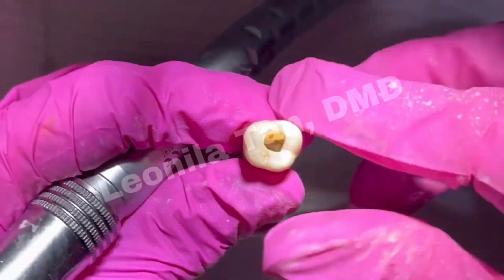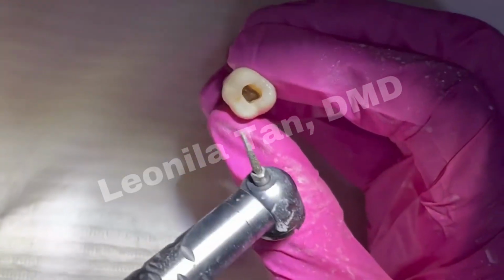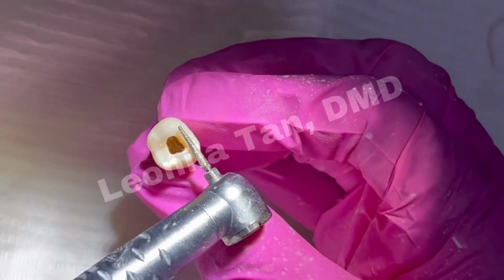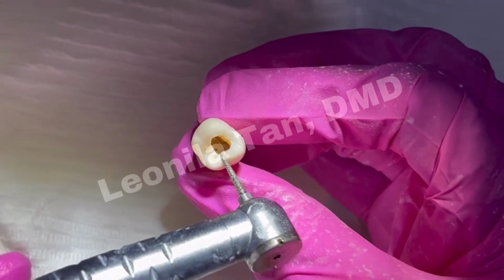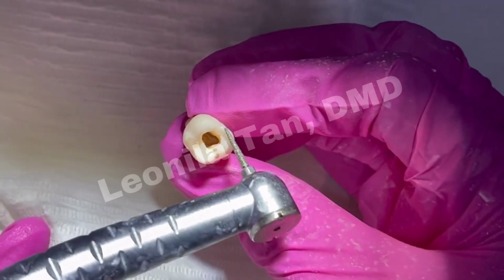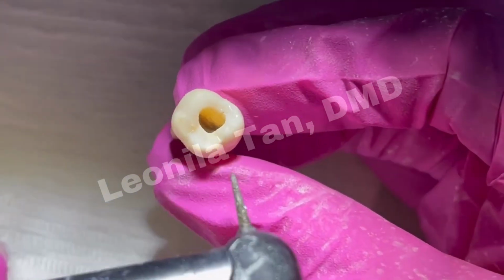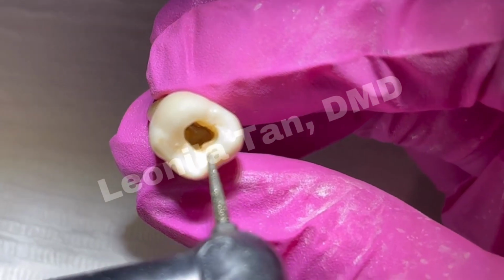Okay, and if you look at your outline form, it's still focused towards the mesial side, though you had to diverge your walls, open up to expose your entire chamber. But notice the marginal ridge is kept intact, wall is diverged. Okay, same thing with the buccal side.